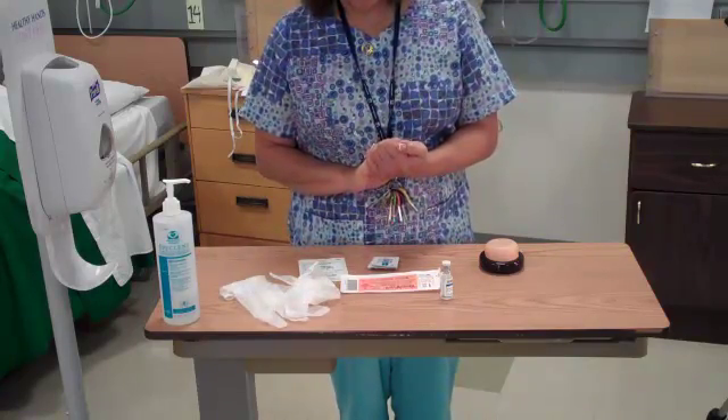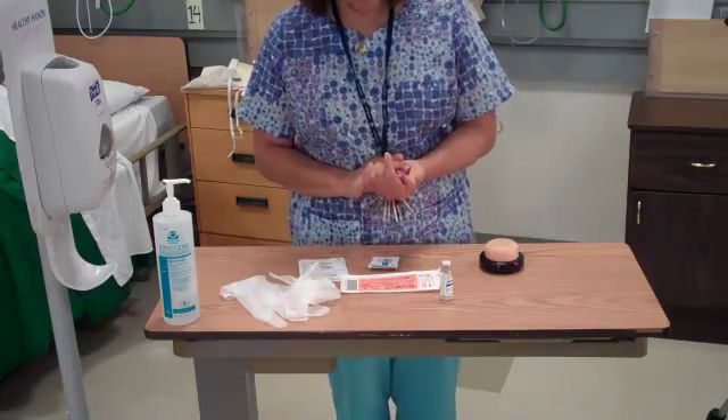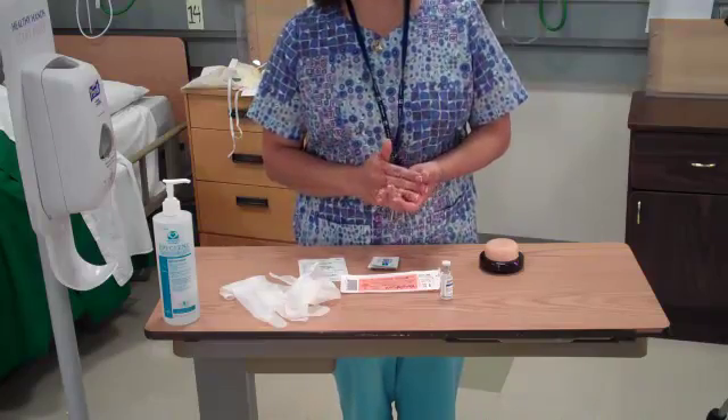Before you give any medication, you need to have your six rights in order. That's the right patient, the right medication, right dose, right route, right time, and right documentation.